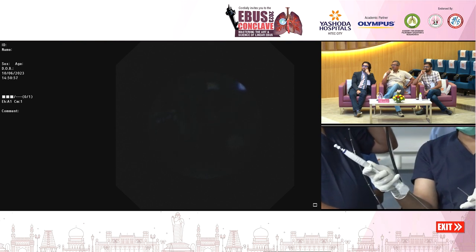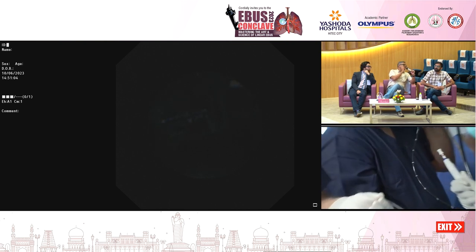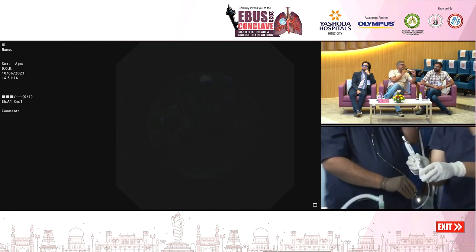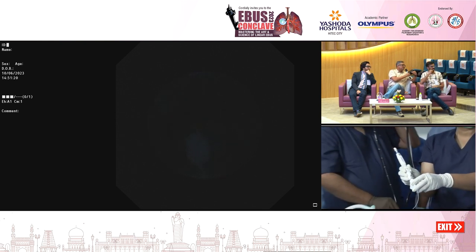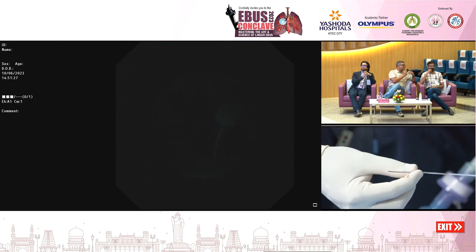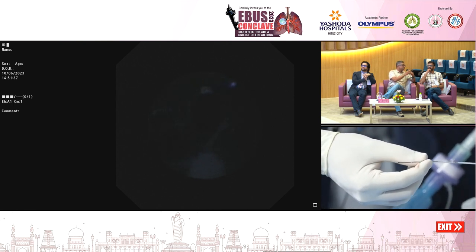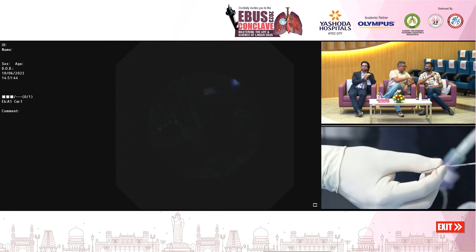Yes, sir. So just for the audience here, there are two things you have to note in the needle. There is one knob which you move, it's only to adjust the length of the needle inside the scope. And there is another part which adjusts the needle length inside the lymph node. Both of them are just adjacent to each other, and that's something that you have to understand. If you read the classical text, there will be about 15 steps described on handling EBUS needles. But if you understand the function of every step, you don't really have to know them in that sequence or in that order. It actually comes to you automatically. So don't read those books and then get bogged down by those 15 steps and try to mug them. It's unnecessary. As long as you understand the function of each of those knobs, your life becomes very easy while doing EBUS. So the needle is a 19G. So yes, you're using the 19G flex needle.